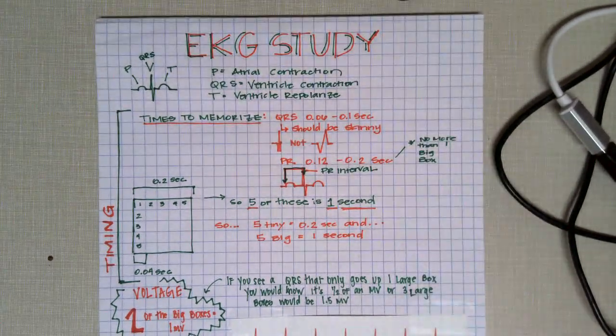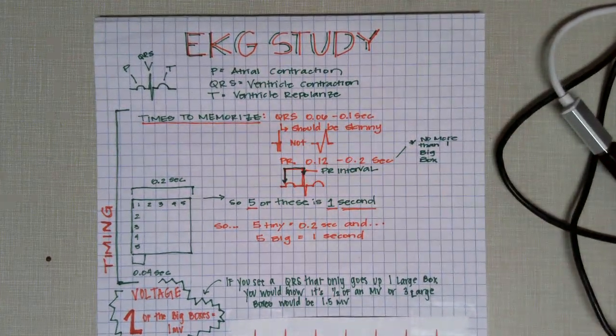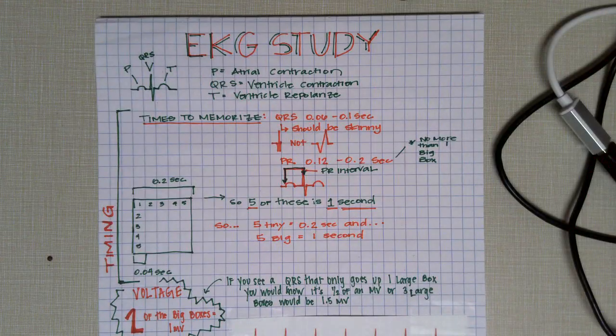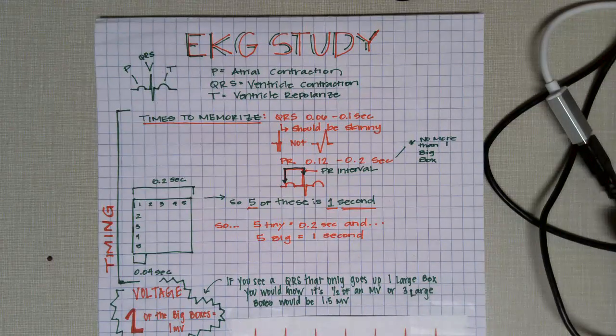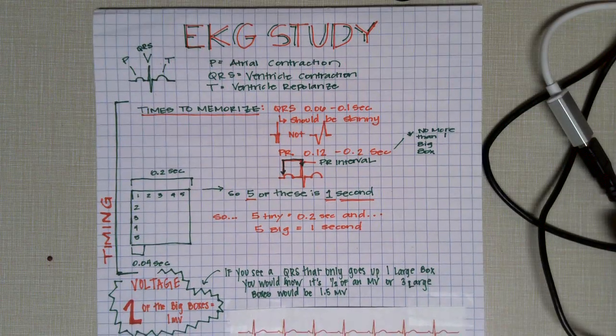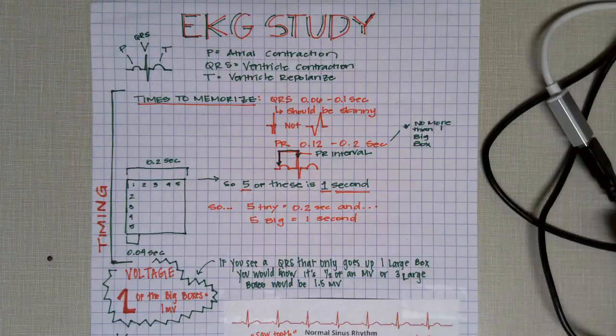We're going to try something new today. I'm going to try doing a little bit of a lecture and posting it for you guys to look at before we start on class. As you can see, I took some notes here today, and I want to show you guys some things about EKGs just to refresh your memory.